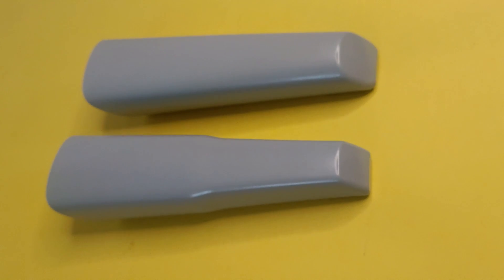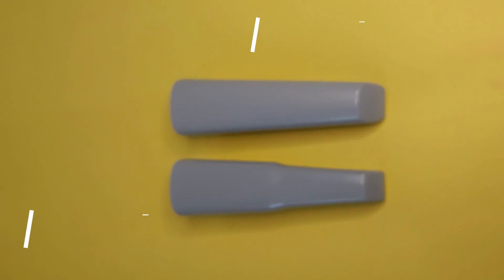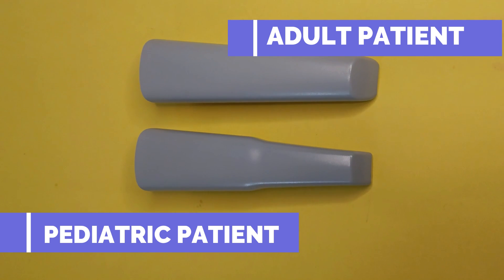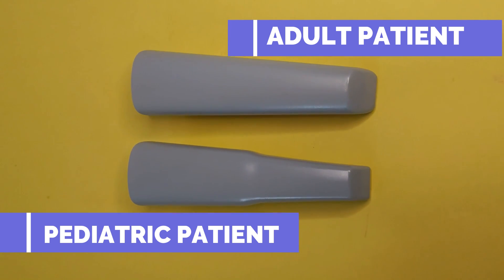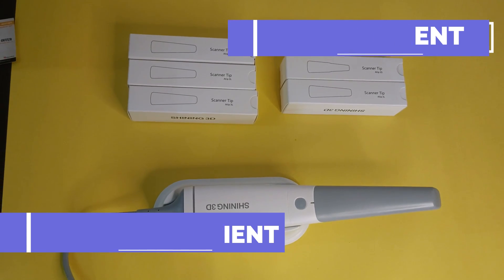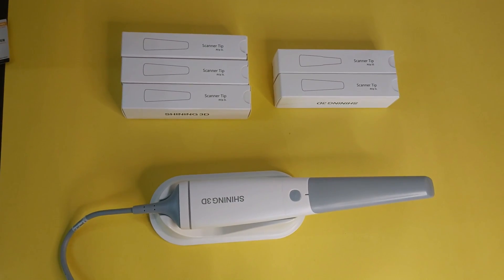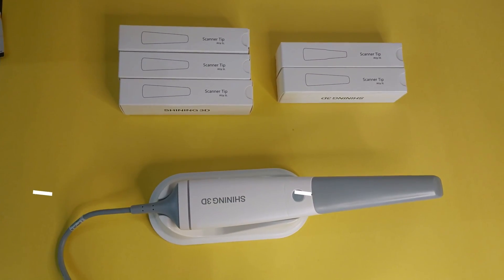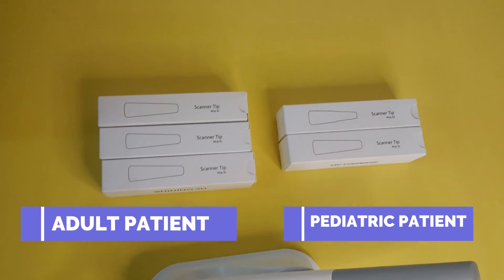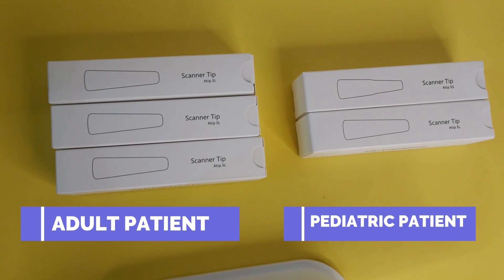There are two different sizes of scanner tips — the broader one is meant for adult patients and the slimmer, thinner one is for children. In total the scanner comes with five scanner tips: three for adult patients and two for children, and each can be autoclaved a hundred times.